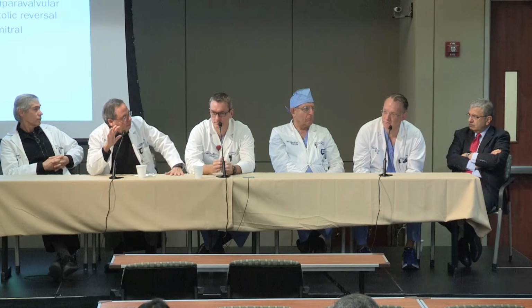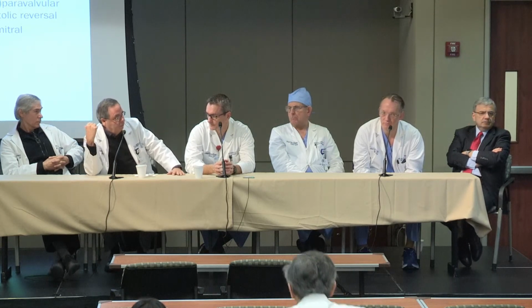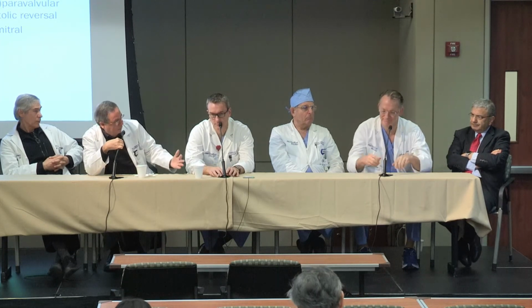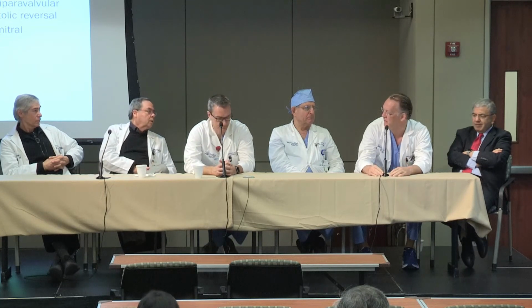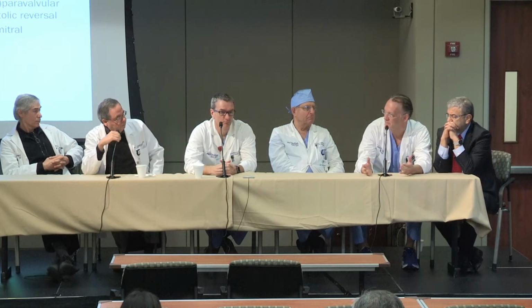Yeah. And I'm asking mostly because you folks are going to go out practicing other places. You may not have this great MRI that we have here, and you may have been stuck just with that TEE finding, and you have to then sit down and make that decision. No, I mean, I was thinking that. I mean, Dipan's not going to like this, but when I looked at it, I was like, we don't need an MRI. We know the problem here. The valve's too low. It needs to be fixed regardless. And the guy's symptomatic, and there's enough leak there to give him his symptoms. We just know mechanistically this valve is not working in that position, so something needs to be done.